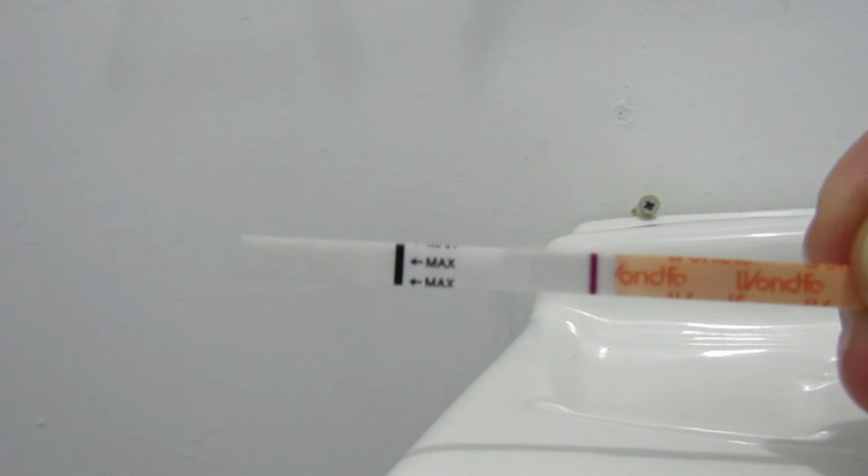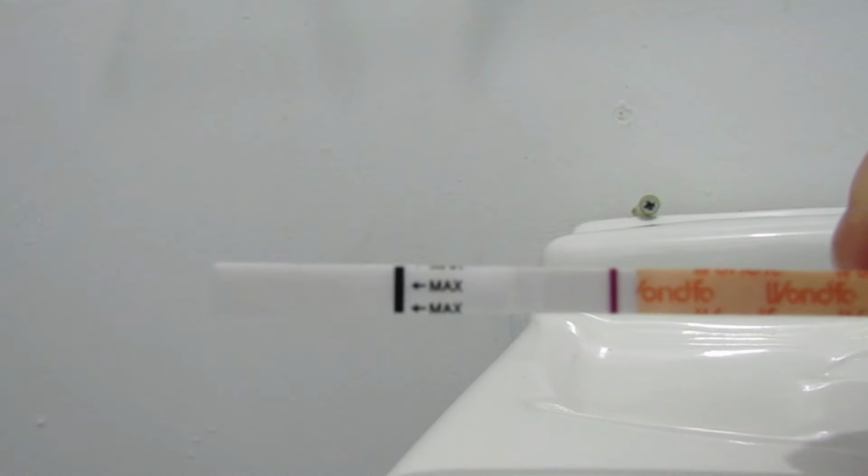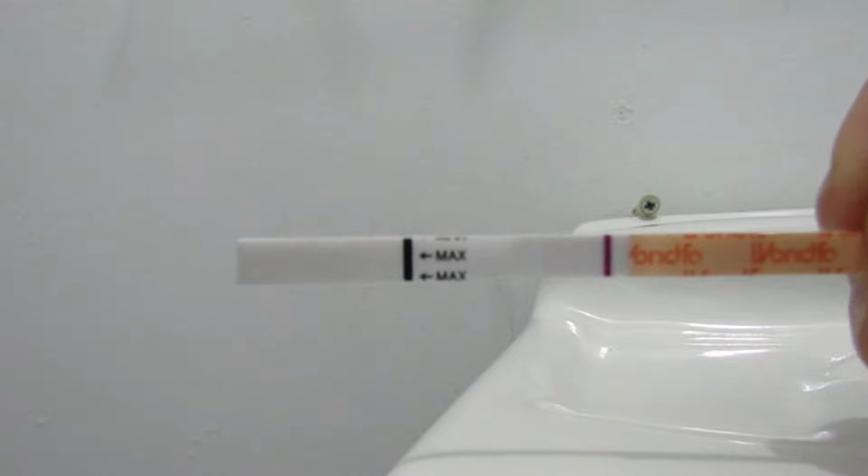Today's 8 DPO test says. Yesterday's, like I said, was completely blank, but I save all my results anyhow, so that if I do ever get a positive, I can have a line progression, because I love to see those and be able to track the changes in the lines. Alright, it has been over 5 minutes, so let's see what this test is saying for 8 DPO.